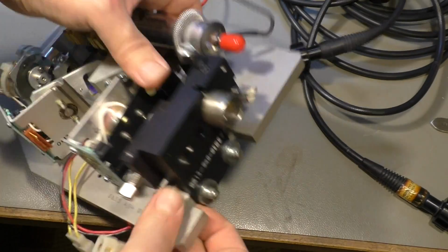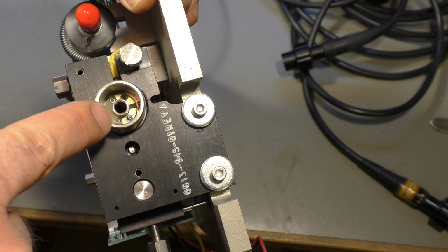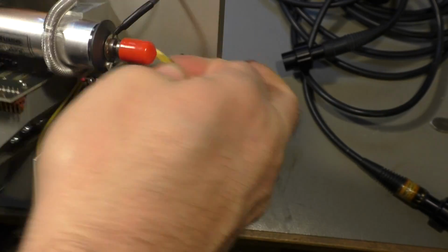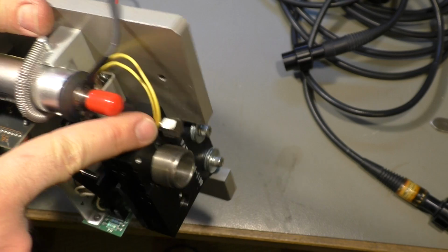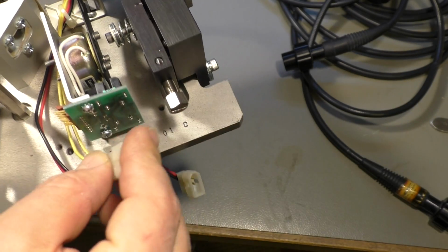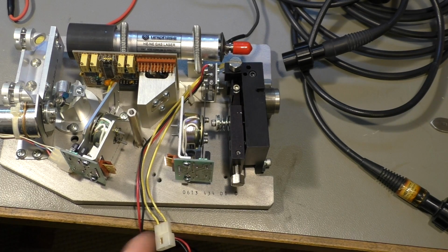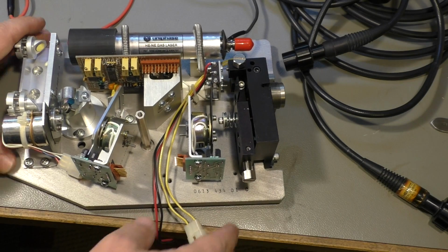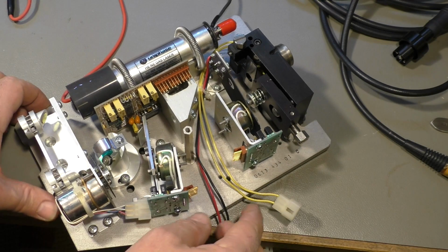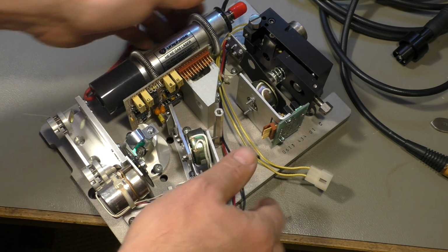And then we have also two connections here. You see a little piece of PCB down here, makes contact to that, and the yellow cable here that comes out from that side here transmits this electrical information, this resistance value, to the electronics board, and then the electronic board or the microprocessor knows what is attached to the fiber and can display, or I don't know what it does. Maybe it regulates the power in another way, or it just knows what is attached to the other end of the fiber, which seems to be an important thing.